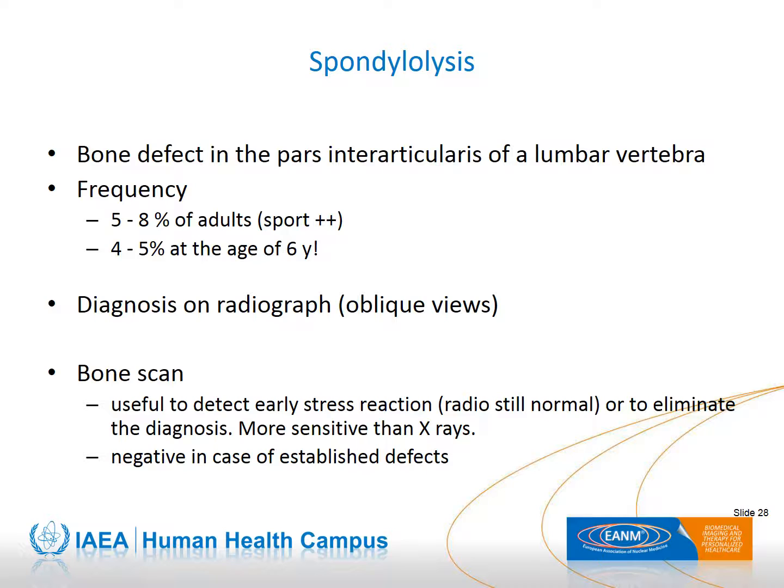A bone scan may be prescribed to rule out early-stage spondylolysis in a patient with lumbar pain, or to date the onset of spondylolysis, as only recent onset forms lead to increased bone tracer uptake. Scintigraphy becomes negative after 6 months, whereas plain radiography remains abnormal.